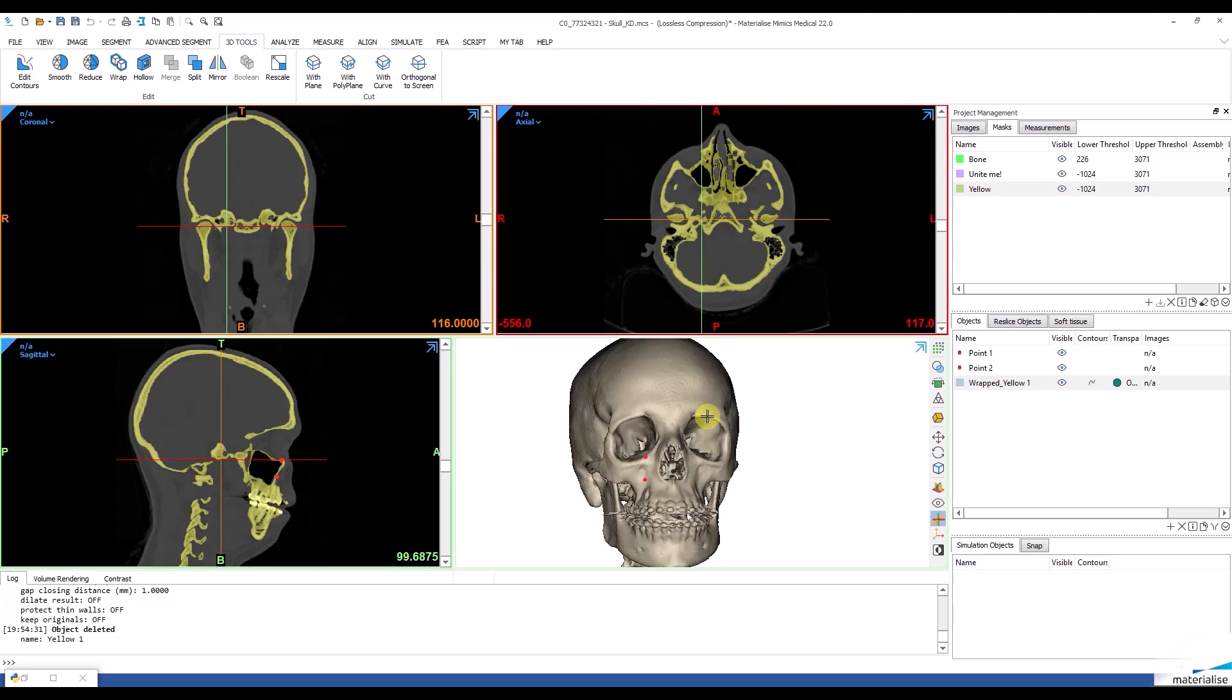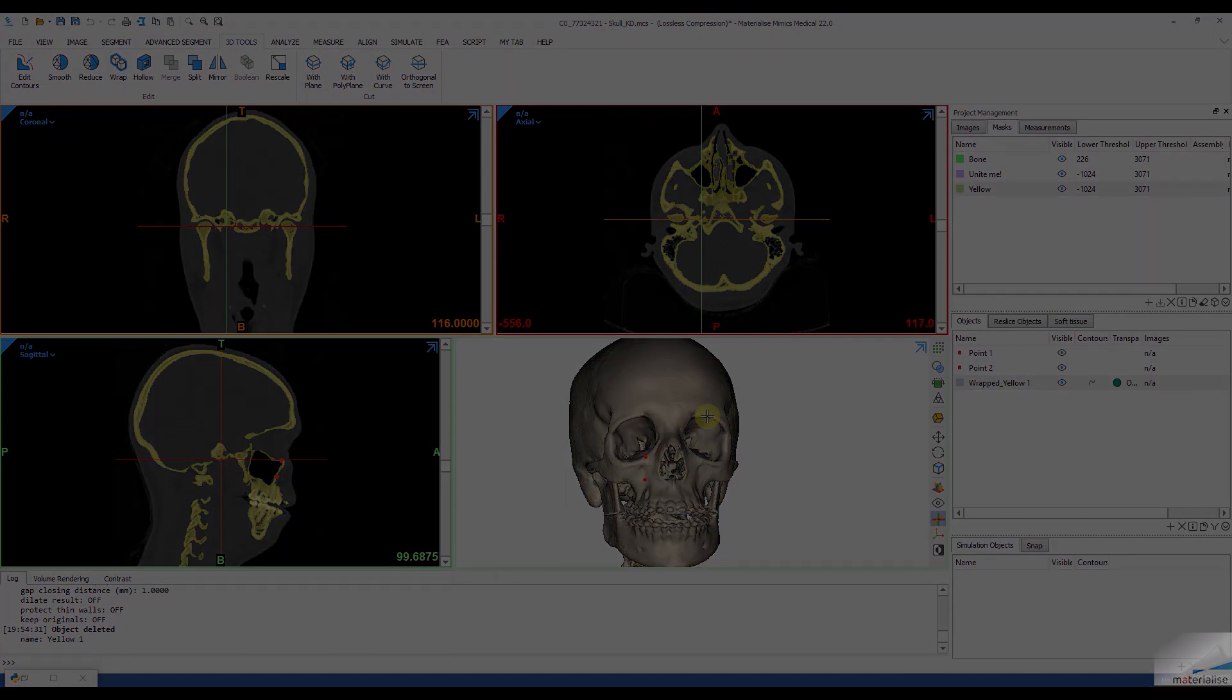So, that is what a workflow looks like. Starting from your CT images, running a script and automatically segmenting the orbital floor and the maxillary sinus. Thank you for your attention.